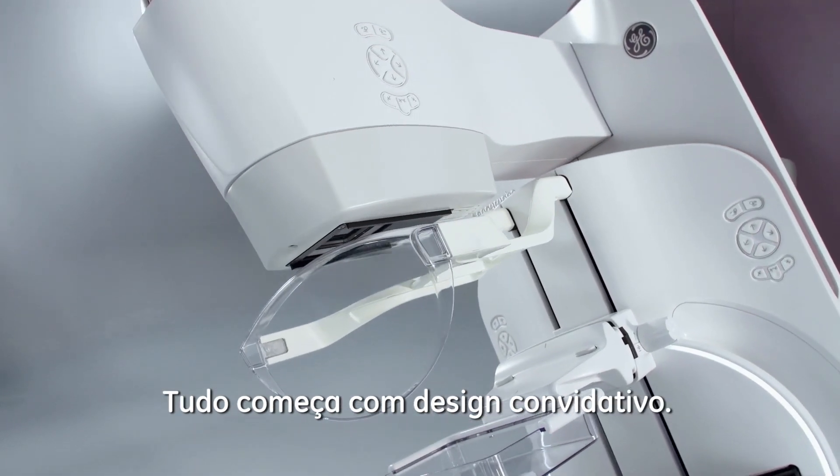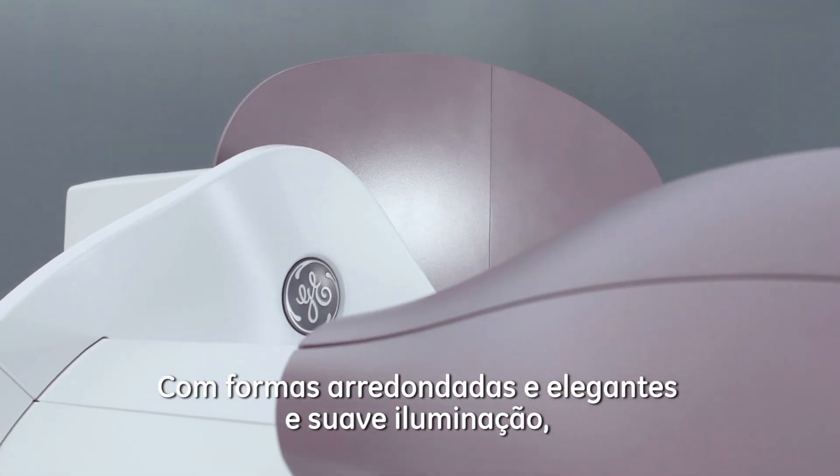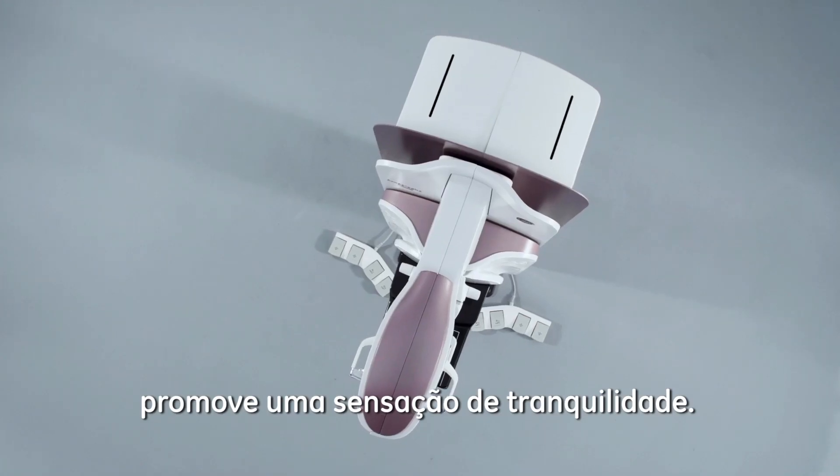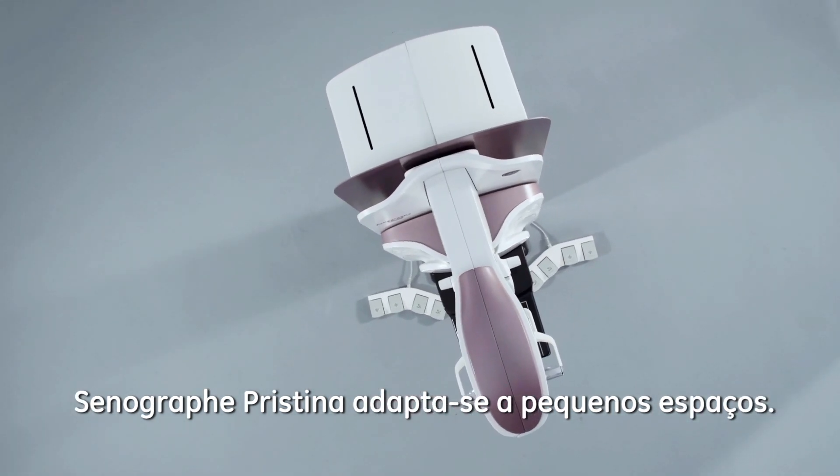It starts with an inviting gantry with elegant lighting and gentle rounded shapes to promote a sense of calm. SeneGraph Pristina fits in small rooms where space is at a premium.